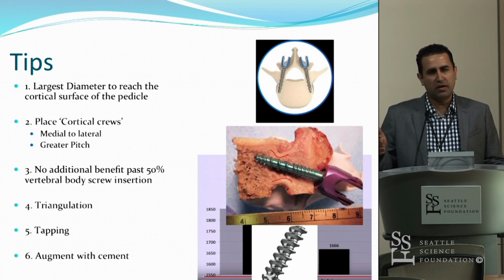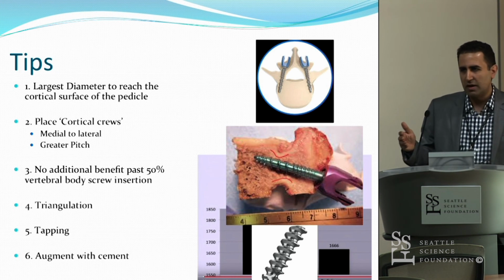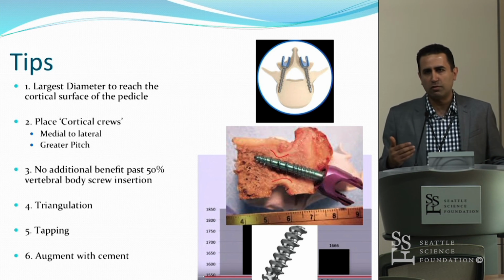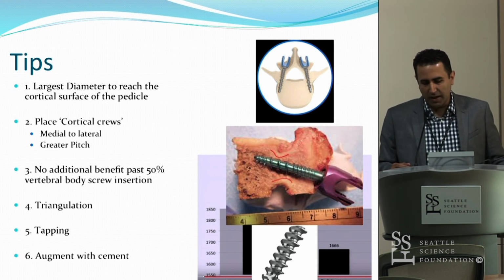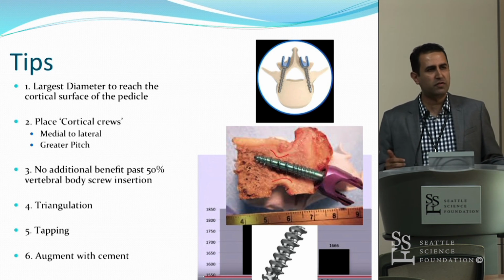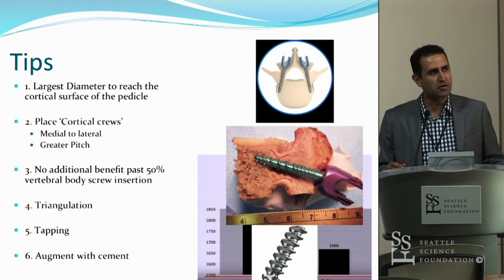So the theory was that you would under tap by one size, 1 millimeter or so. For cortical screws, you don't need to do that because, in principle, you're not going to remove that tough bone there. So you tap to size. I think the advantage is that firstly, it makes insertion of the implant much easier, but also it improves its pull-out strength as well, by a little bit, not by much.